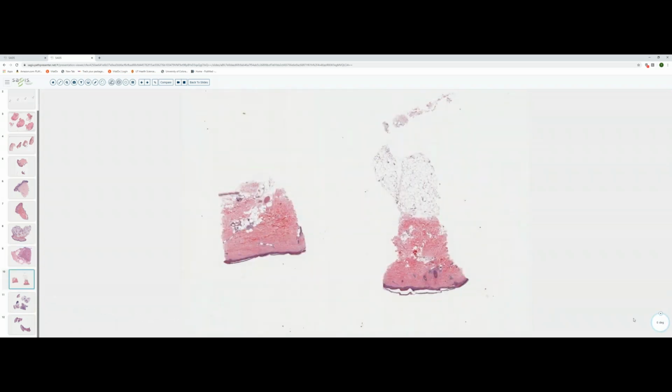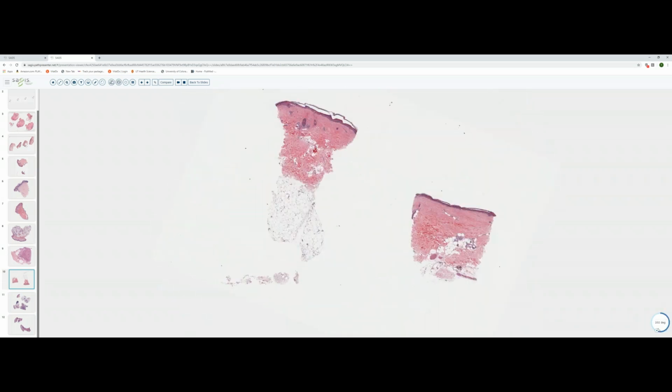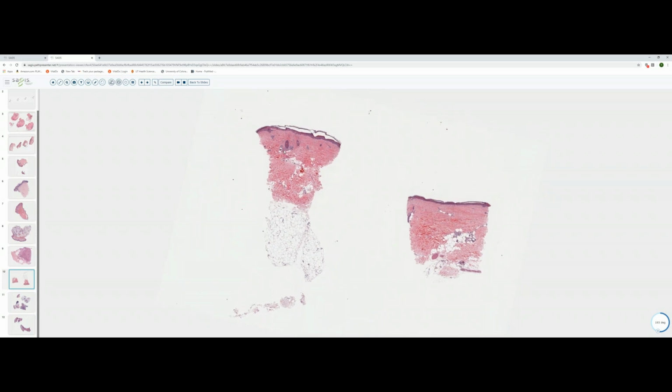Slide 10. Slide 10 was a tough one. Very subtle. This is something that you probably do on an inpatient consult service. This is a punch biopsy. This was from distal extremity. One clue that we're dealing with distal extremity here is the fact that the dermis is relatively thin, and we've got a fair amount of subcutaneous tissue. And think about it, when you biopsy more distal, you're going to get more fat than you would if you biopsy trunk or proximal extremity.